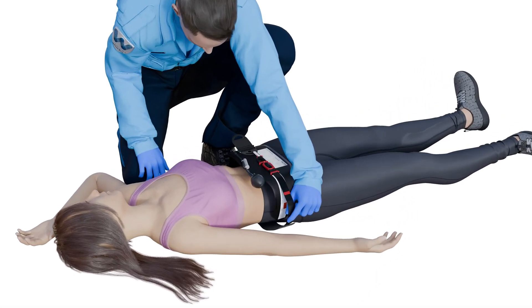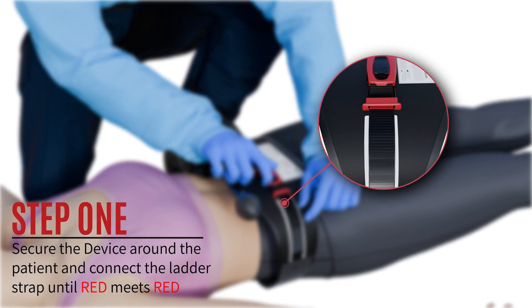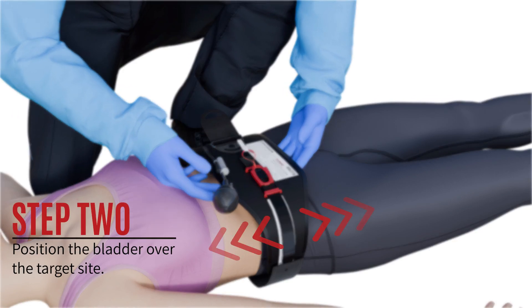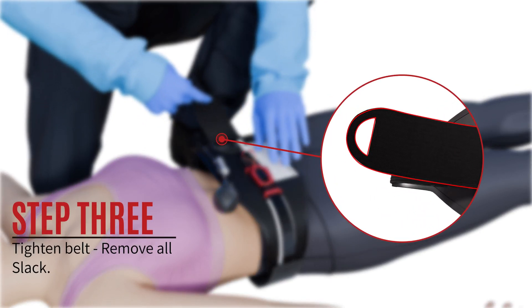Step 1: Place the AAJTS around the patient and insert the ladder strap until red meets red. Step 2: Position the bladder on the abdomen over the umbilicus. Step 3: Remove all slack from the belt and tighten.